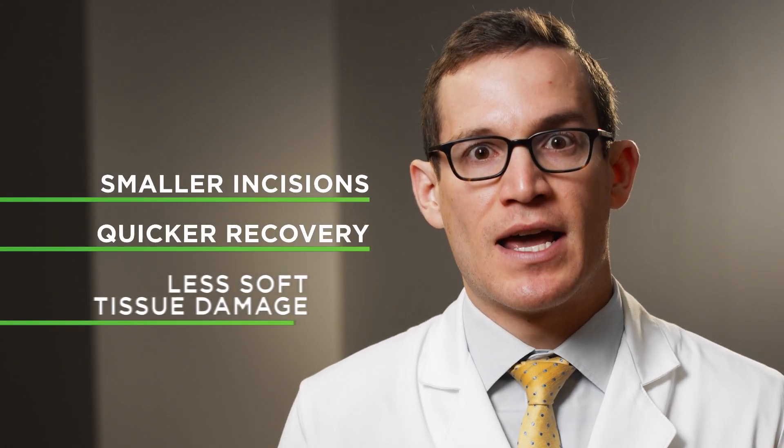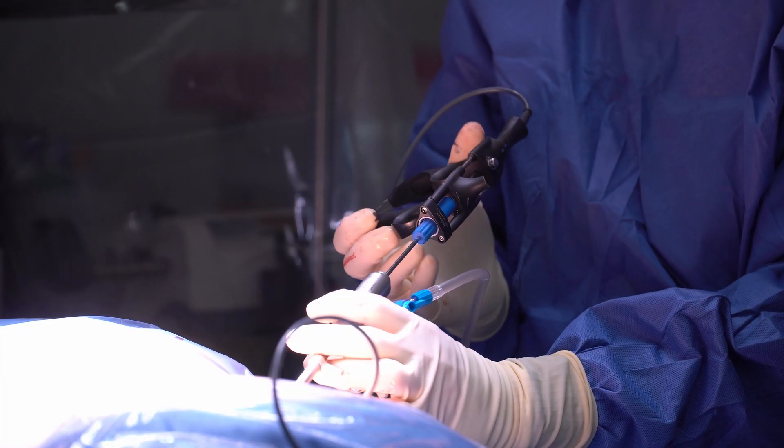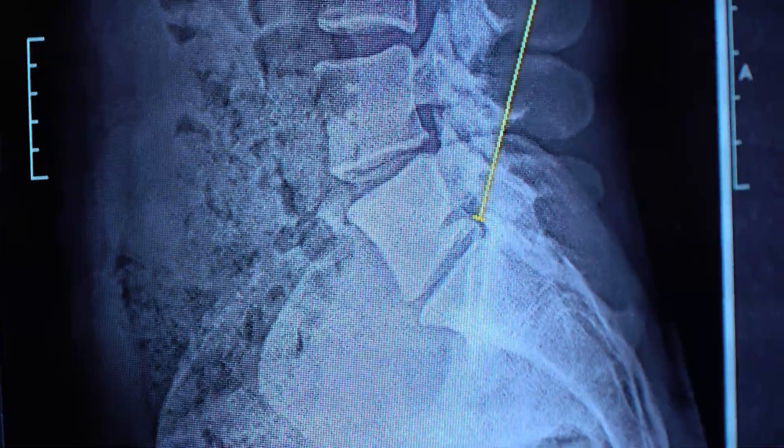Beyond smaller incisions, quicker recovery, and less soft tissue damage, the beauty of endoscopic techniques is they allow surgeons to access areas of the spine that previously would have required a fusion surgery. On multiple occasions I've done outpatient endoscopic non-fusion surgeries on people who otherwise would have required a fusion. The problem with fusion is it involves additional surgery, takes longer, and oftentimes involves a more protracted recovery.